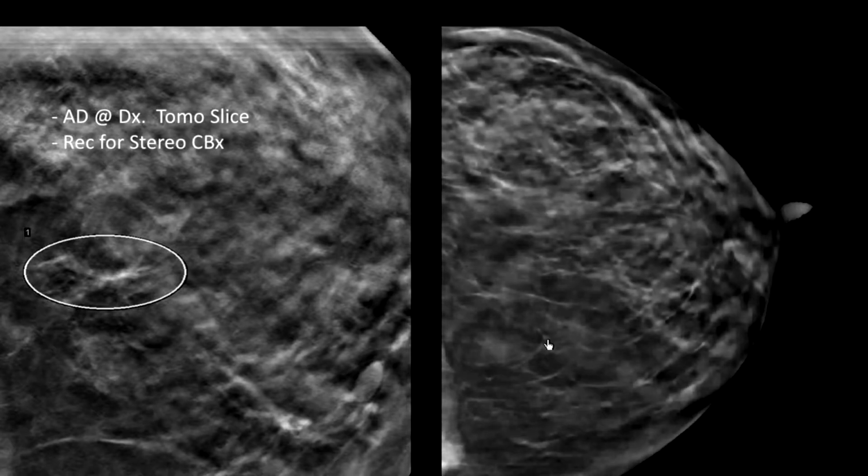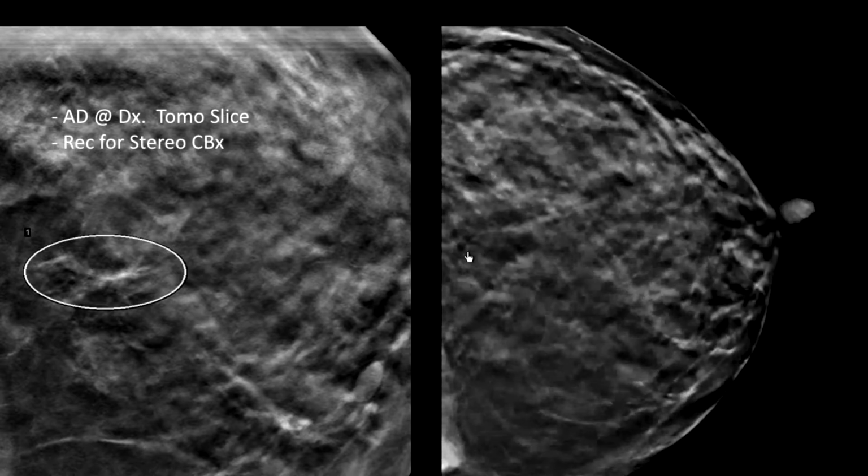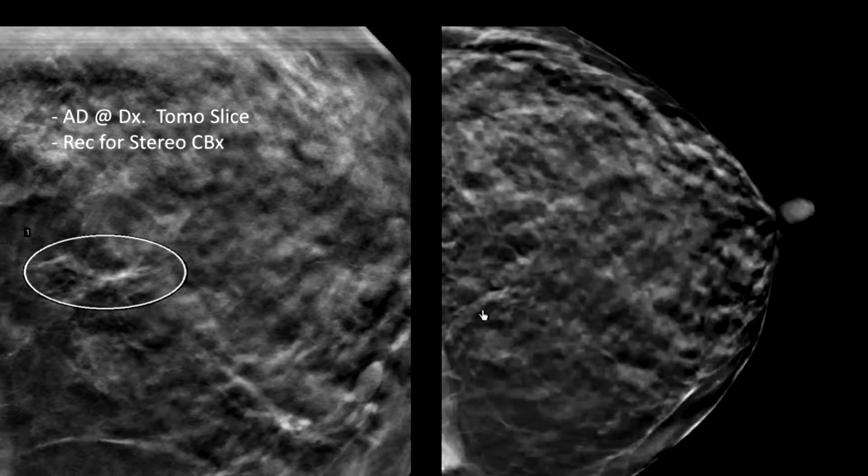And let's see how well this shows up. So it's going to be right in here. And again, you can see that this is just going through this way. We're lacking those straight lines in a spoke wheel fashion out here in the fat. And let's see if it's still running. So much for trying to get those AVIs to work. And it's not moving. Sorry about that.